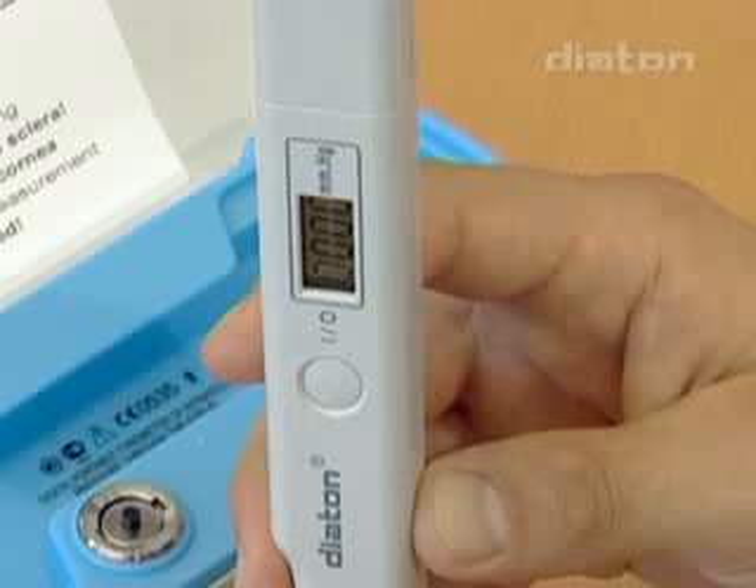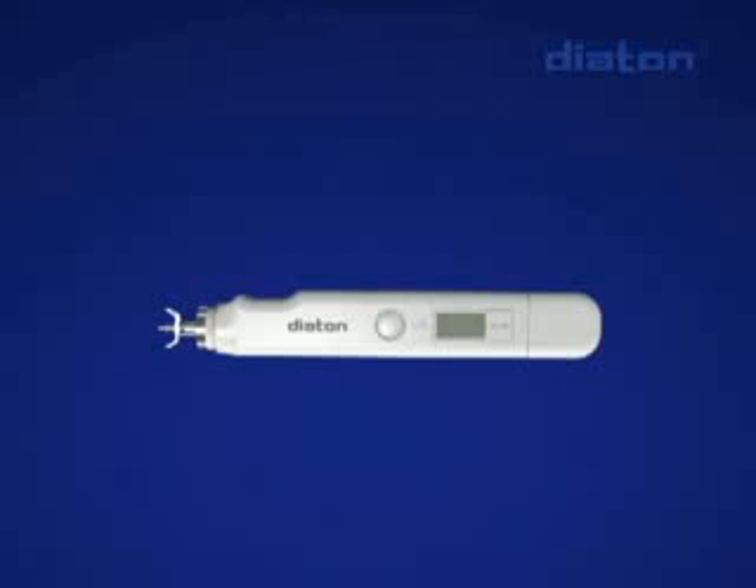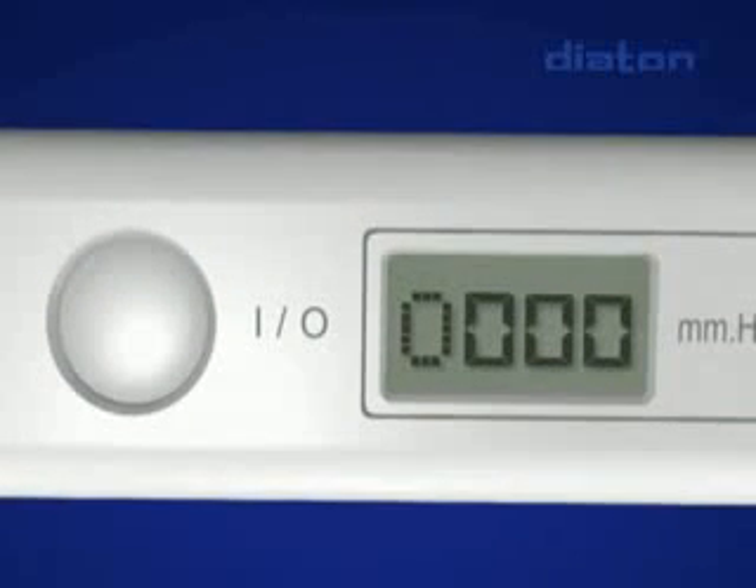The tonometer features automated receiving of IOP indication as a result of averaging several measurements. The tonometry result appears on the display.